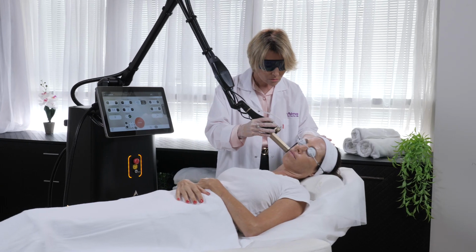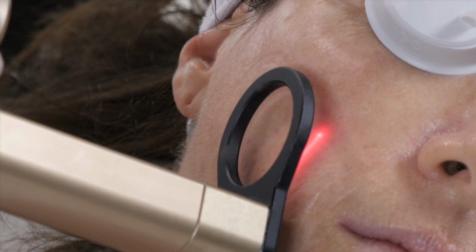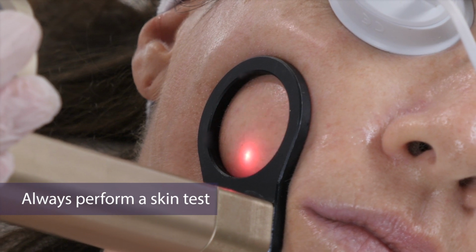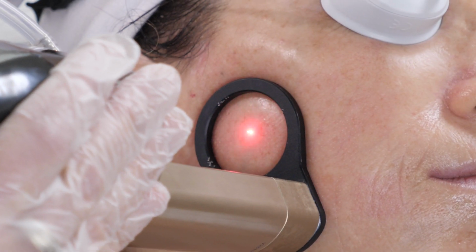Work in a stamping method. For ideal coverage, space the scanning areas next to each other with no overlap. Always perform a skin test. Change the size of the scanning area as needed.